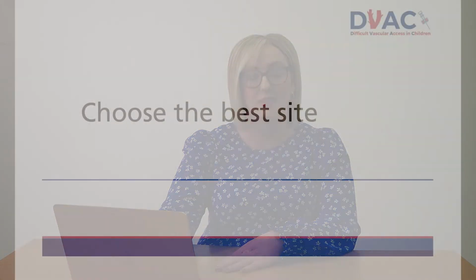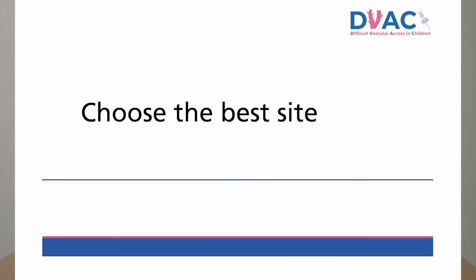Choose the best site. Choosing the best site to have the best chances of succeeding on your first try will be of utmost importance. Your choices might be somewhat limited based on previous attempts taken by others. And it's also worth discussing how many of our patients with chronic conditions have had repeated attempts at vascular access over the preceding months or years, their parents will often know exactly where you'll have the best chances of being successful, so do listen to them when they give you some hints.